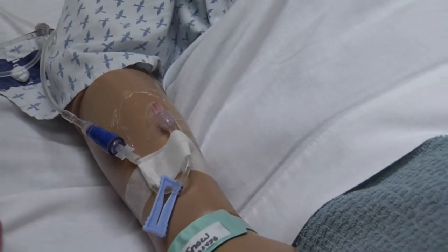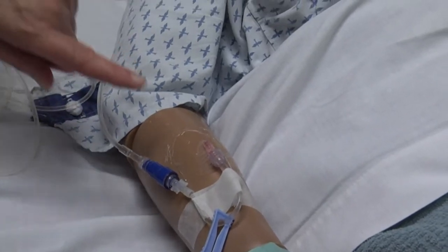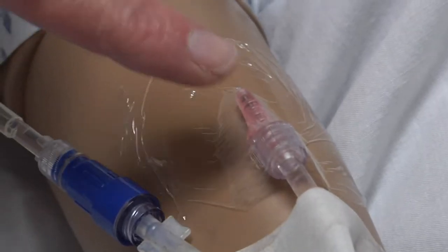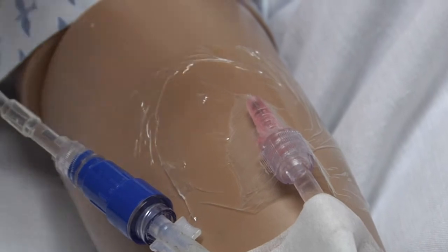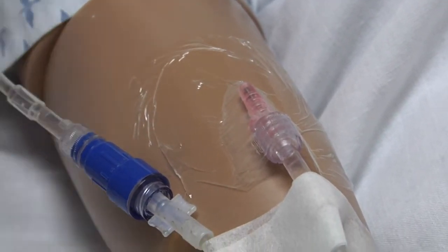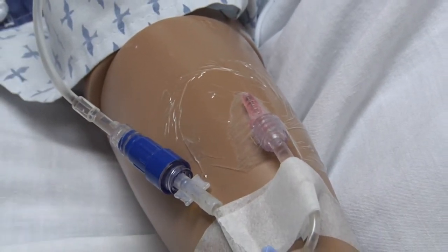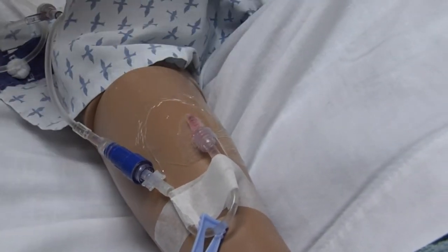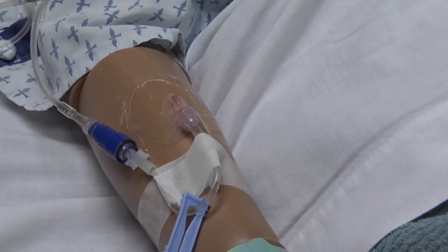The fourth problem that may develop with an IV is that it could start to ooze, have some small amount of bleeding right here at the site where the catheter goes into the patient's arm. If that is the case, I can take this dressing off and clean it up and see if that fixes the problem by maybe stabilizing the IV a little bit better. But many times that's an indicator that this IV is no longer going to function very much longer, and it would have to be discontinued, and the IV would have to be restarted in a new area.